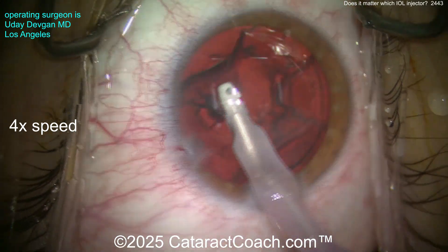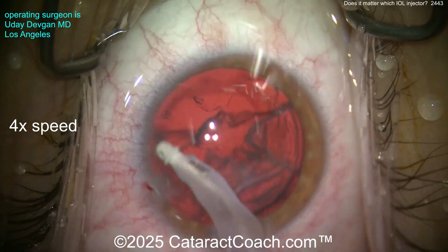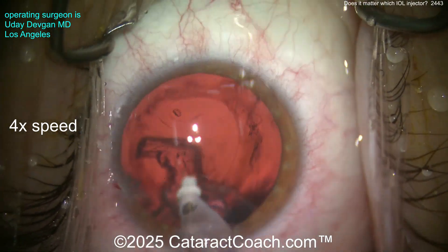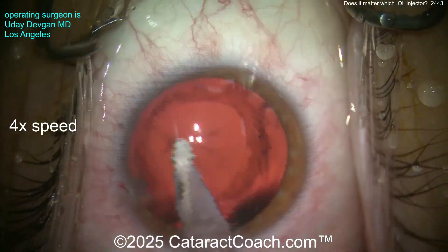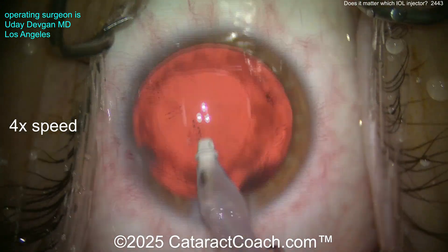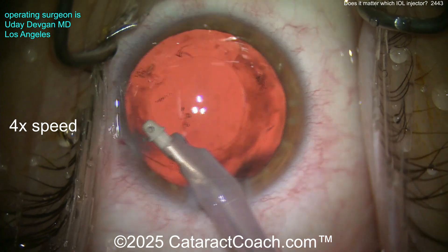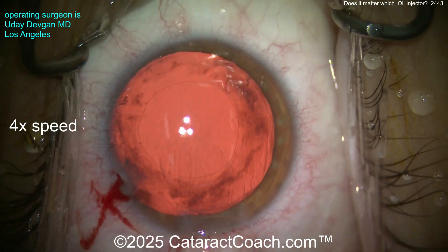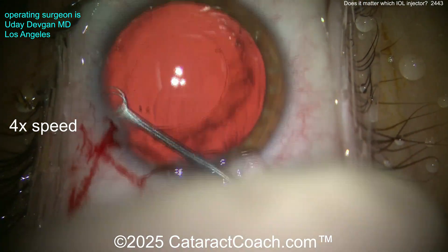I'll load the lens myself. The question is: can you interchange the injector for one 6-millimeter optic three-piece hydrophobic acrylic lens with another manufacturer's brand? The manufacturers tell you to use only their injector with their lens, but are they truly interchangeable? Let's polish up the capsule and I'll show you what we're going to do.